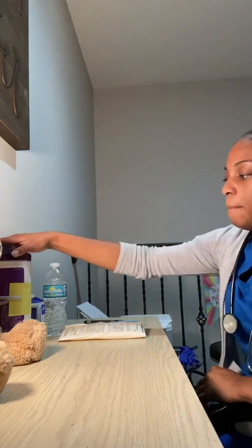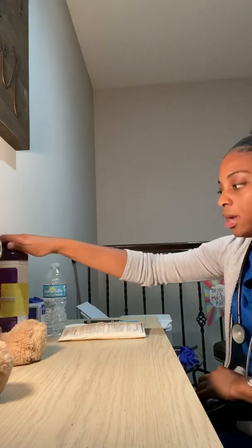Okay, so now we're moving on to my trach suctioning. My patient has a trach that we're going to be suctioning. Her O2 sats are at 89%. Respiratory rate is at 32. She's showing signs of some respiratory distress and a need to be suctioned.